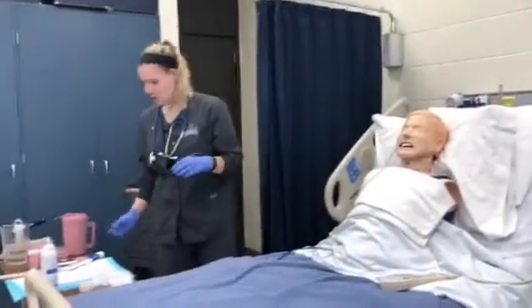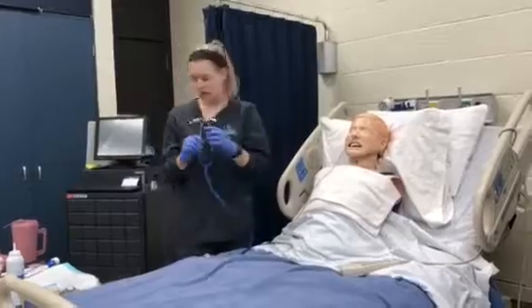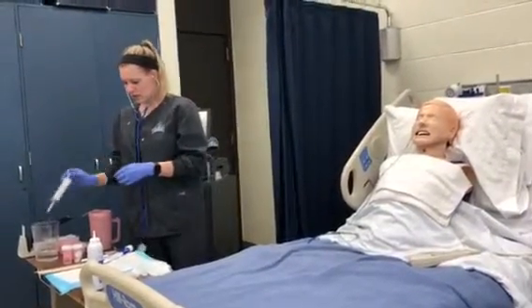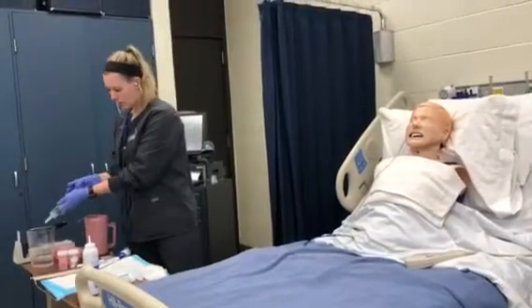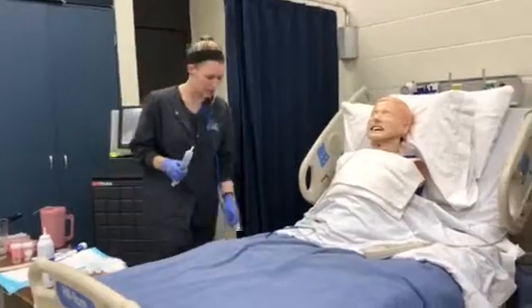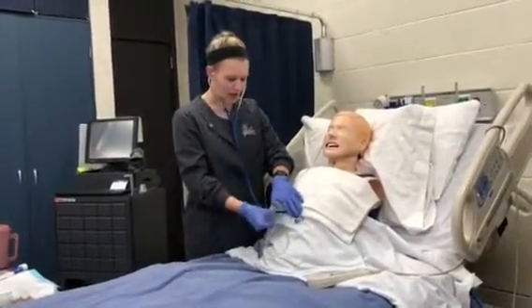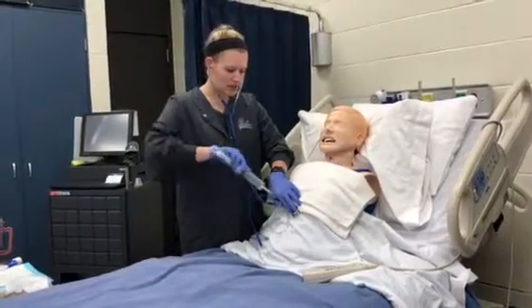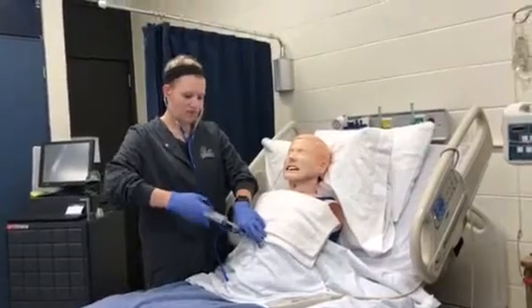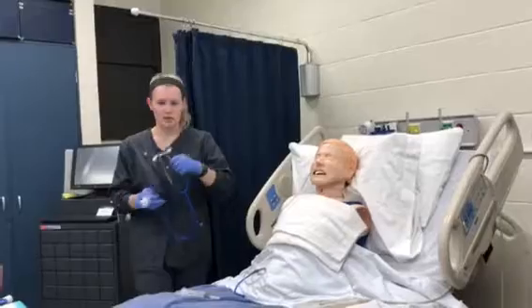Don't need that anymore. So I would then check by 2 ways, actually 3 ways, but I'm just going to do 2 and talk about 1. So I'm going to listen over the stomach and insert some air into the tube, and what I'm listening for is a swishing sound to know that I'm in the right place with the tube. Okay? So that's one way to tell that I'm in the right place with my tube.